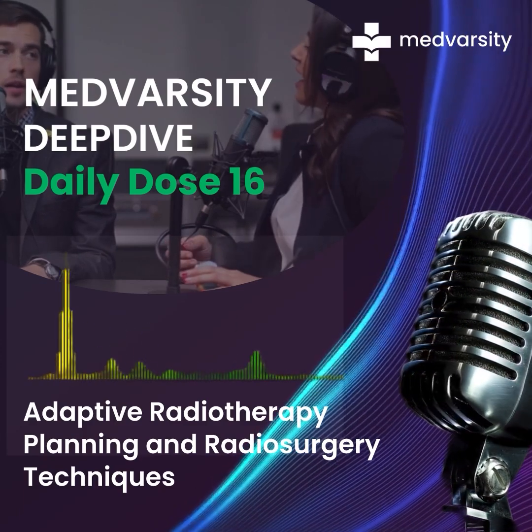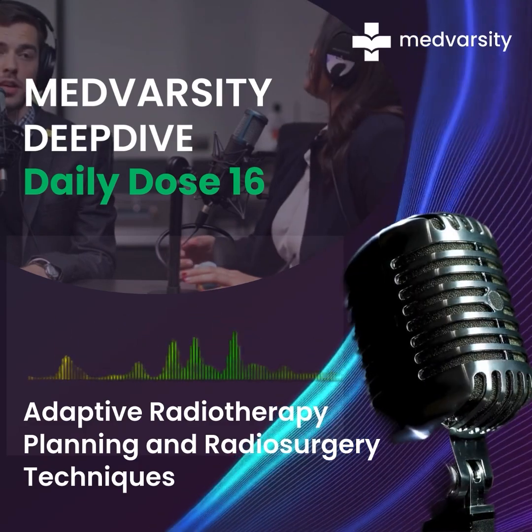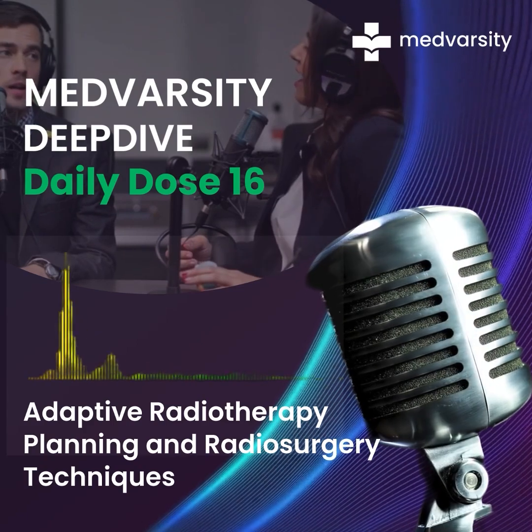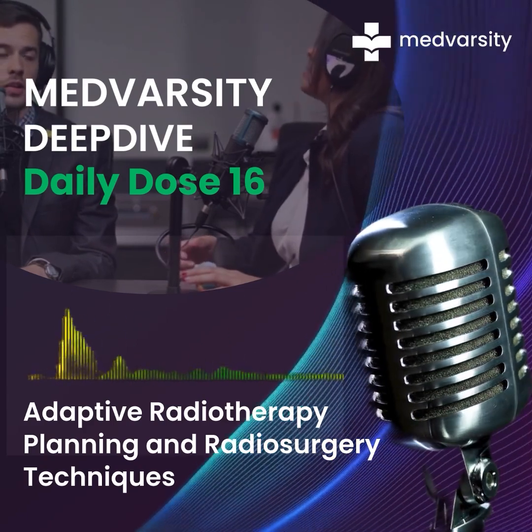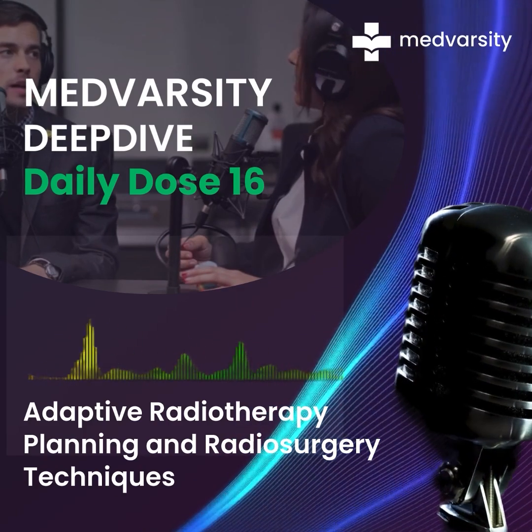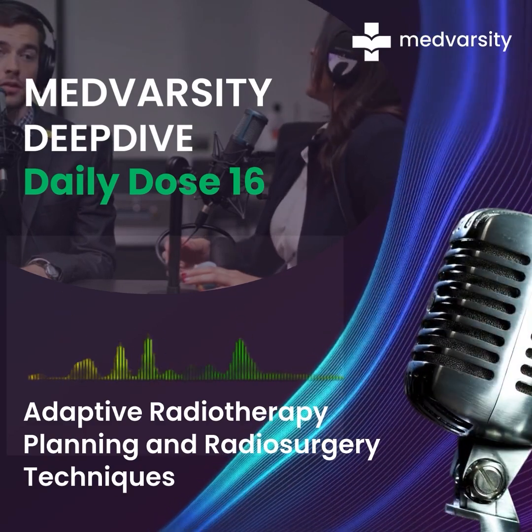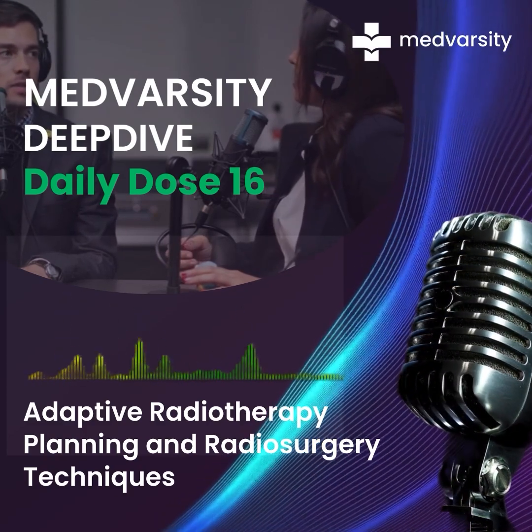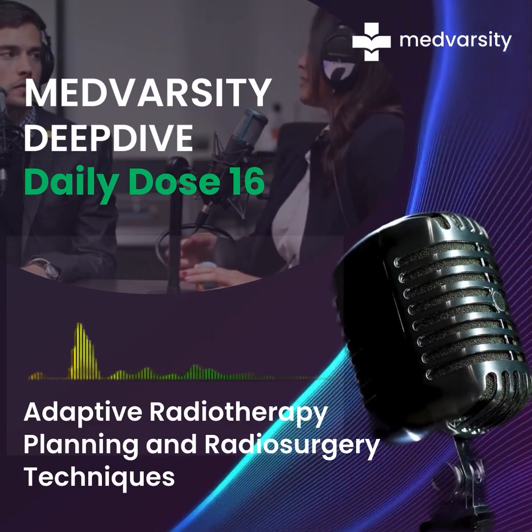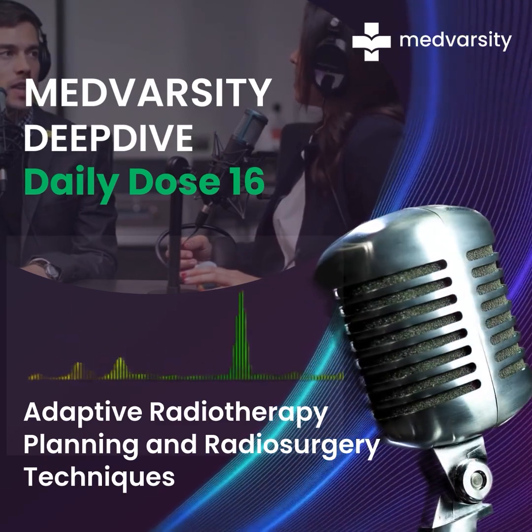And to make it even more precise, CyberKnife takes that radiation beam and divides it up into thousands of tiny little beamlets. Beamlets. That sounds tiny. They are incredibly small, but each one is carefully controlled and directed to a very precise point. Okay. So by combining all of those beamlets from all of those different angles, CyberKnife basically sculpts a very, very focused dose of radiation that conforms perfectly to that tumor shape. So it's not just blasting the area with radiation, it's concentrating all of that energy into one tiny point to minimize the damage to the surrounding tissue, but maximize the impact on the tumor. Exactly. This is amazing. It is really cool technology.